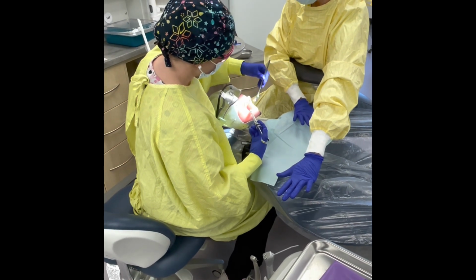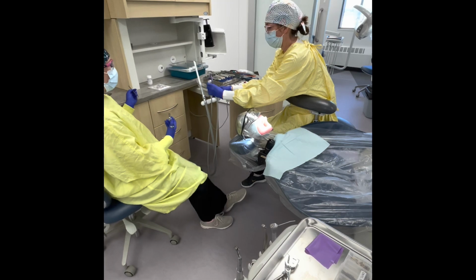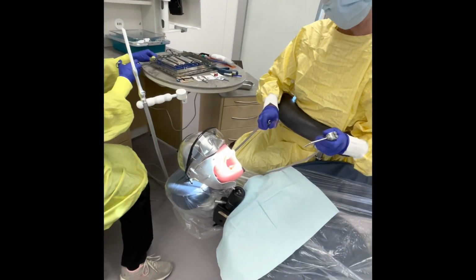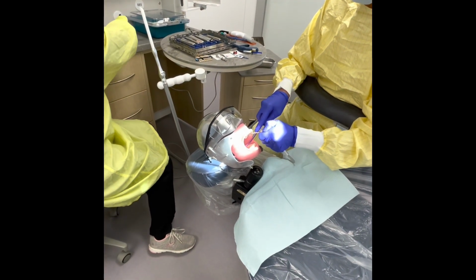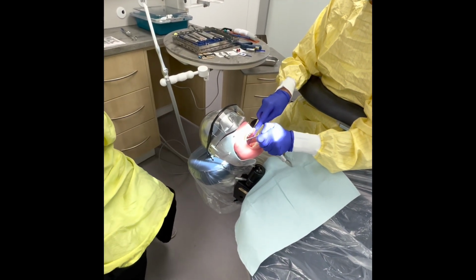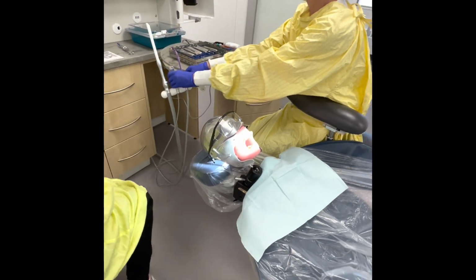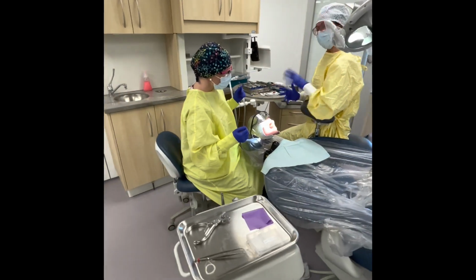Okay, so the anesthetic is now complete. I will come back around the back of the counter. The first thing I'm going to do is give the patient a rinse because, as we all know, anesthetic tastes horrible. I don't have water in mine. Perfect. Okay, so our anesthetic has now been completed.